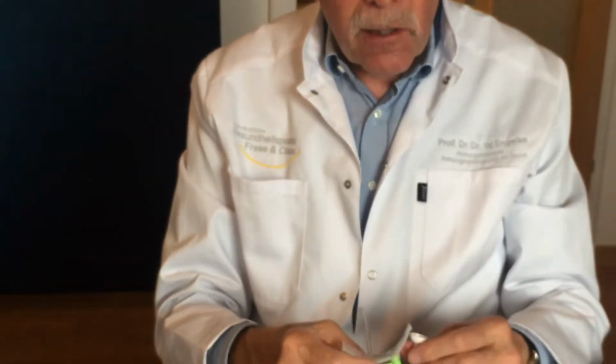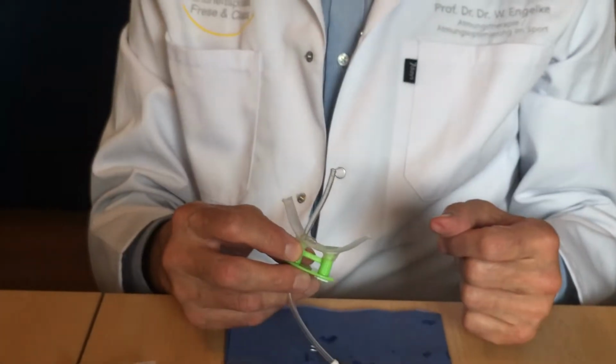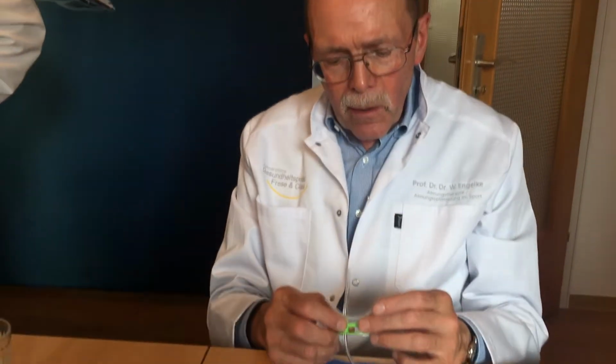Without negative pressure, you have to pull only without force. It is easy to pull the device out, although the muscles, the perioral muscles, are activated.